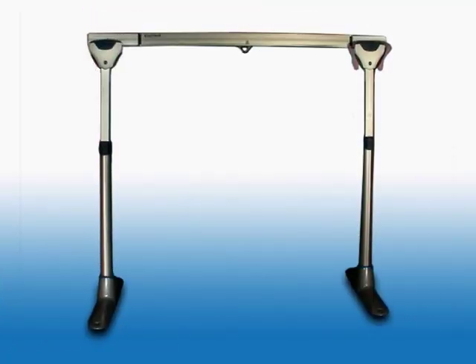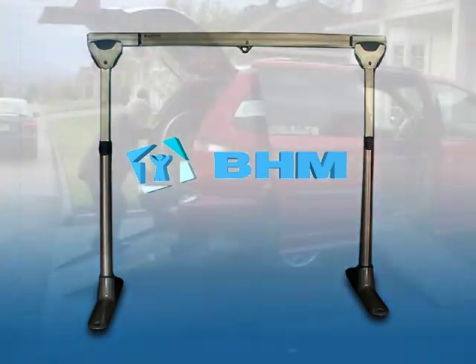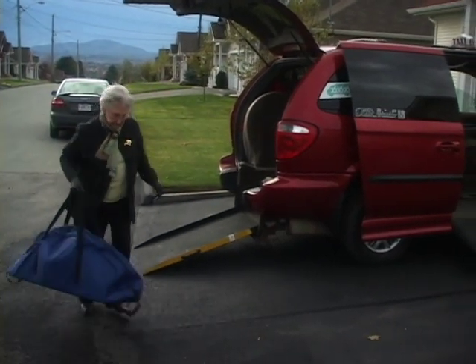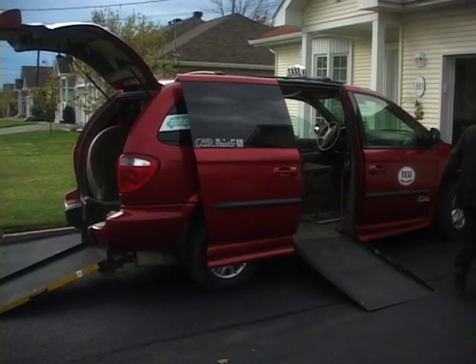We're pleased to introduce EZ-Track FS, a portable lift system that's easy to transport and quick to assemble. It is the ideal lift and transfer solution for the home, and portable enough to take with you on a trip or any overnight stay.